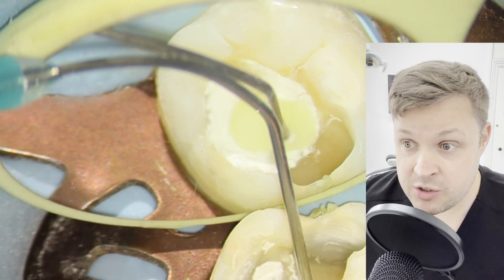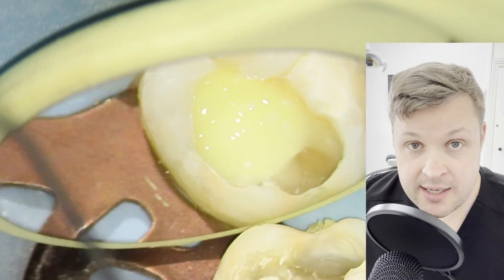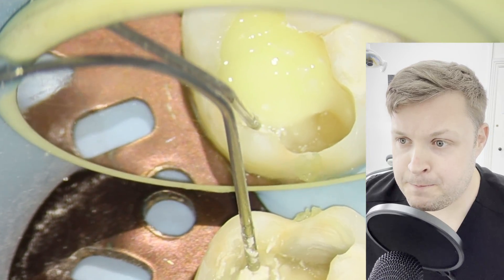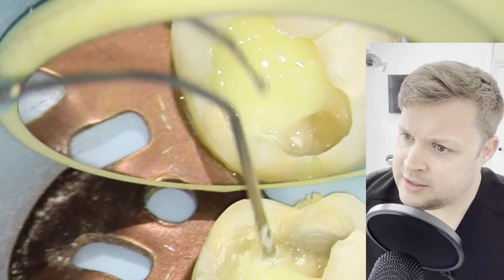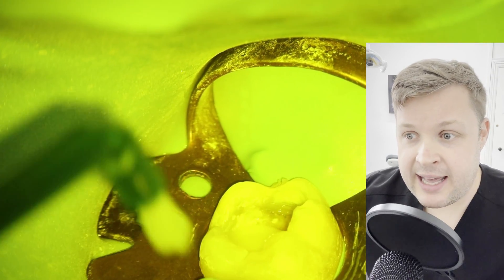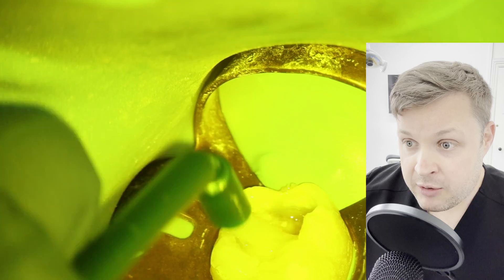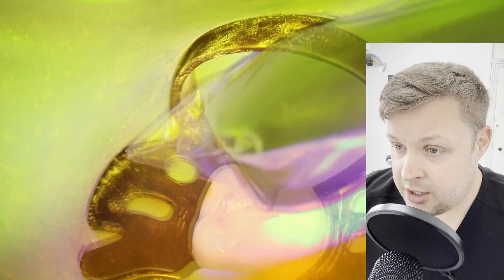Now I'm using a light-cure glass ionomer — this is called Vitrebond. It's mixed and then placed into a little carrier. I'm now going to bond using iBond, and then light cure. Over the top of the Vitrebond GIC I'm going to apply a flowable composite and set that.